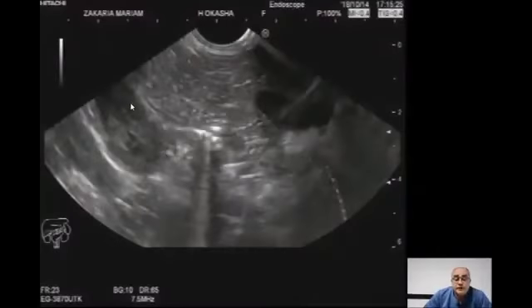Okay. This is an example of a somewhat large papillary mass seen from the stomach by examination through station 4 and anticlockwise. This is a large papillary mass, and this is the lumen of the second part of the duodenum seen from the stomach, and this is the distal end of the common bile duct with a plastic stent inside, and this is the venous confluence, and this is a large part of the head of the pancreas.